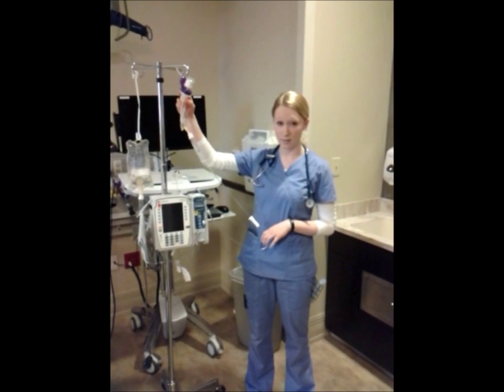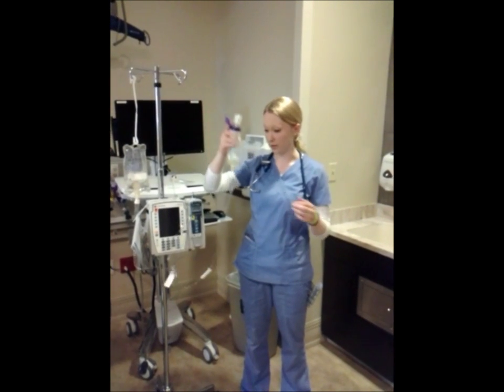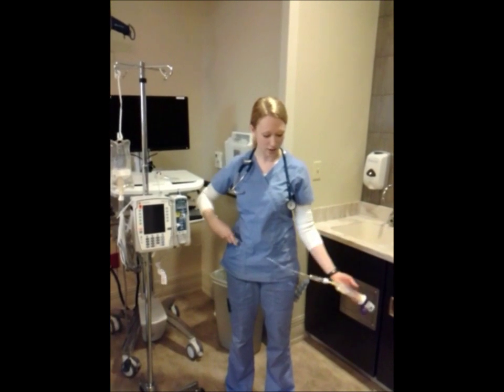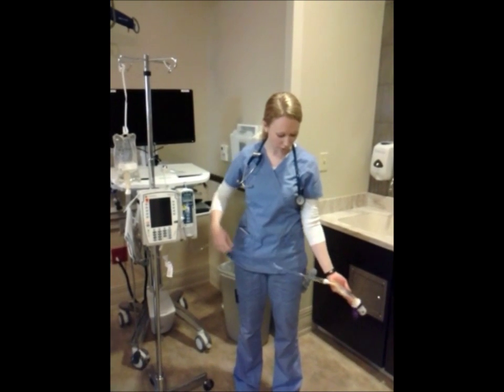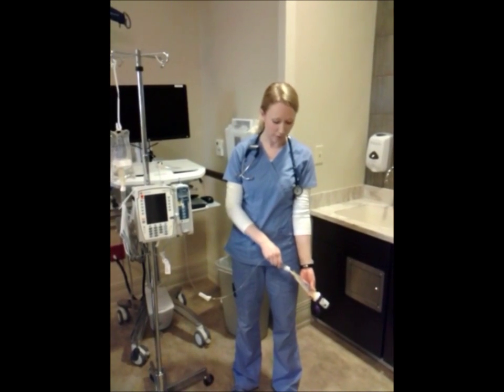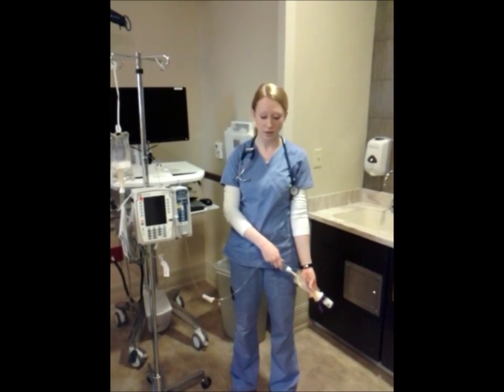So when I'm ready to hang my second antibiotic, or whatever piggyback you have, I'm going to take it off and actually drop it down below the level of the primary. This allows the bag to flush, so we don't have to worry about the compatibility between secondary medications.